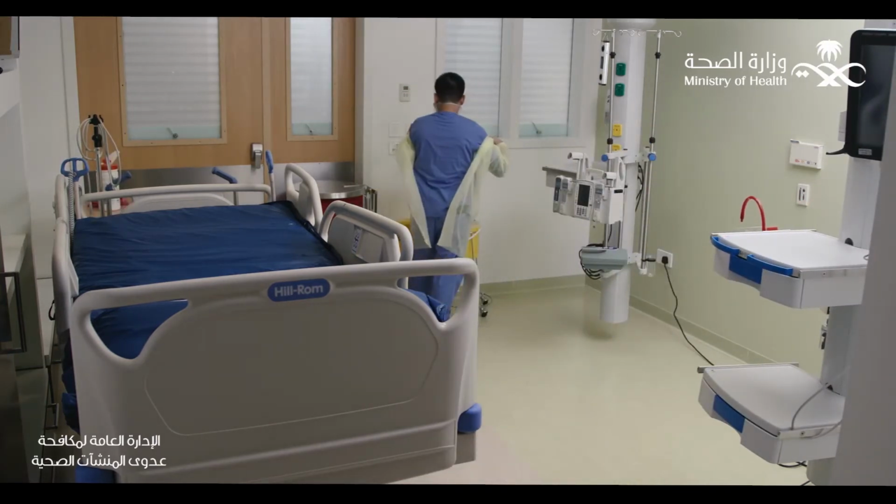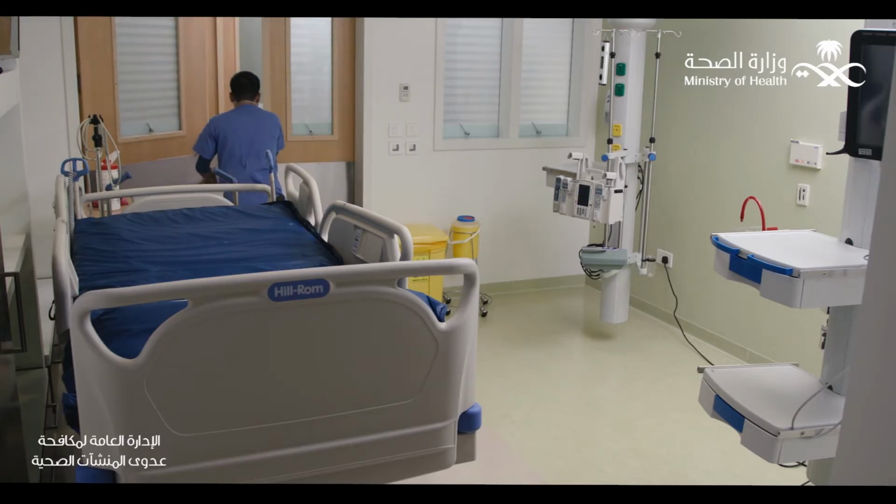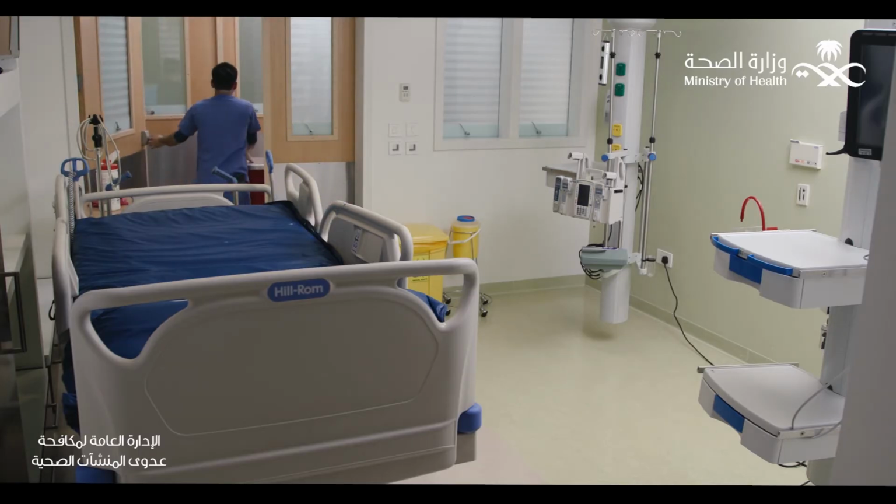Then the healthcare provider has finished his mission and removes his personal protective equipment, including the isolation apron. He went out of the room wearing a highly efficient respiratory mask to clean inside the entrance room of the patient.